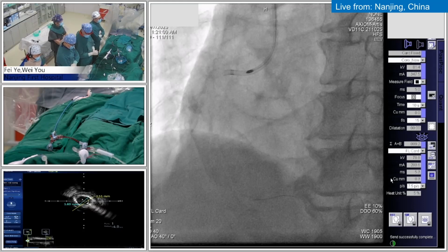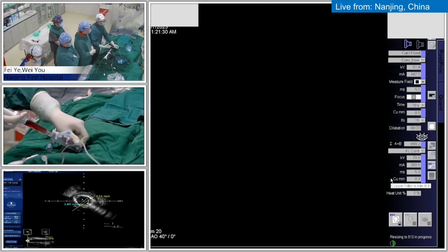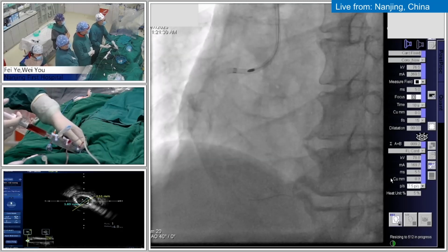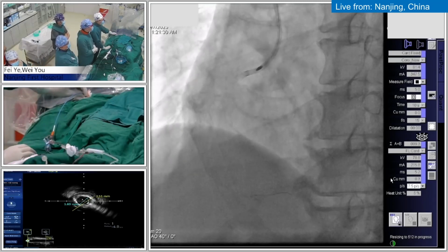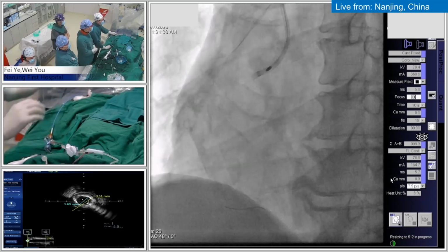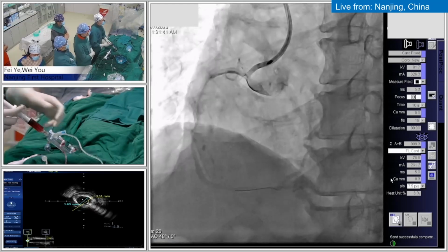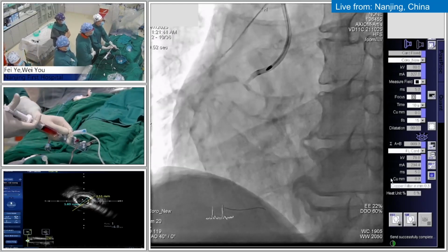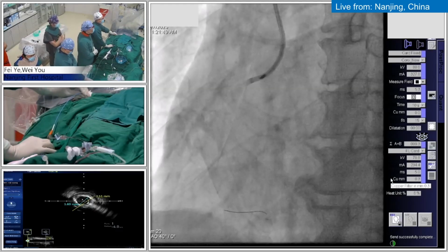Yes, 5,000. Put it back. Check the angle, because there is a phenomenon. Heartbeat slow. Push a little. I will retrieve the burr, getting calcium. Check the angle. Check too much. Okay. Flow is good. Okay, Chief. No problem. If we find the burr pushes very quickly.